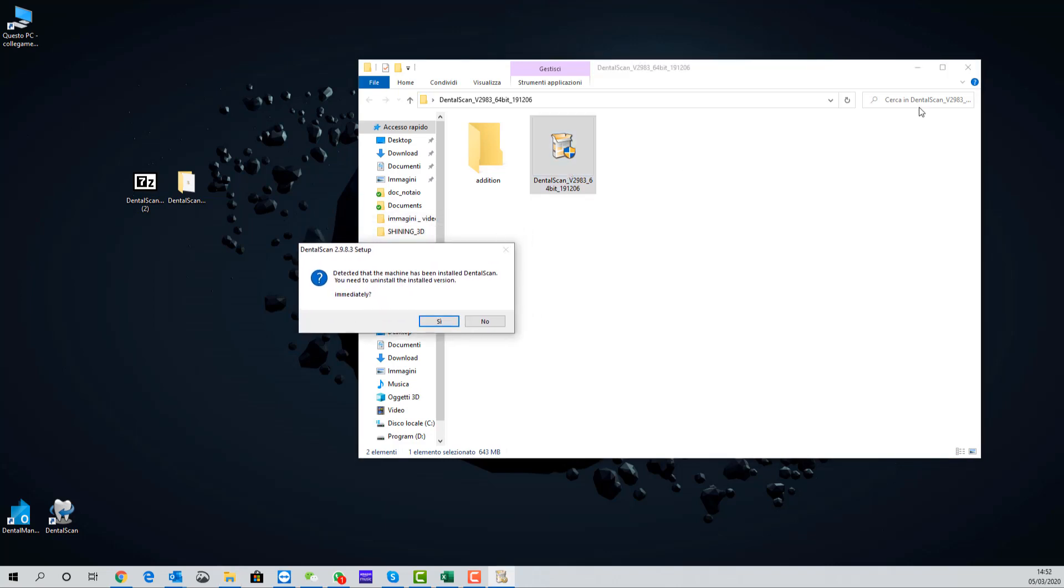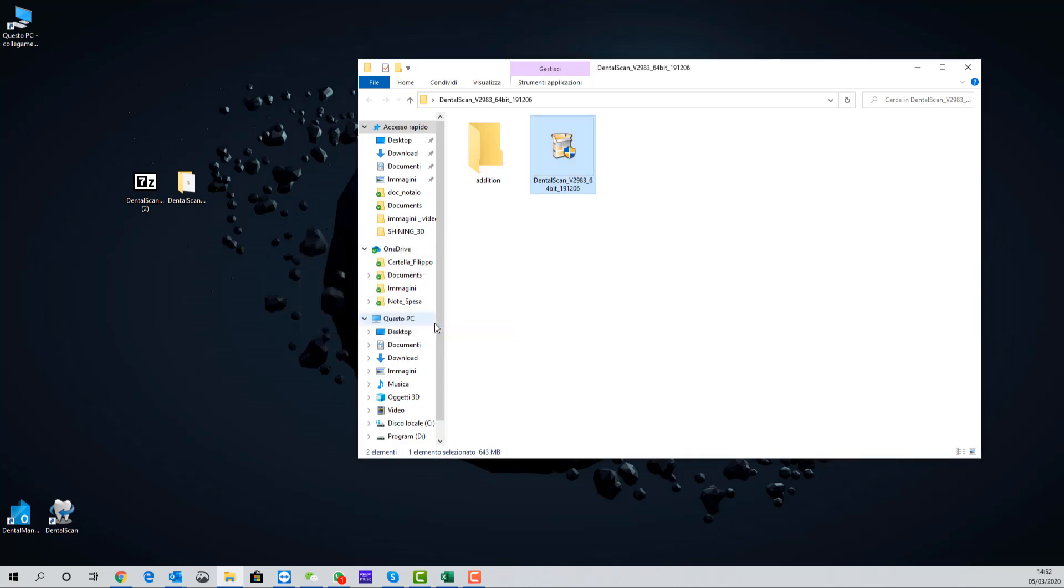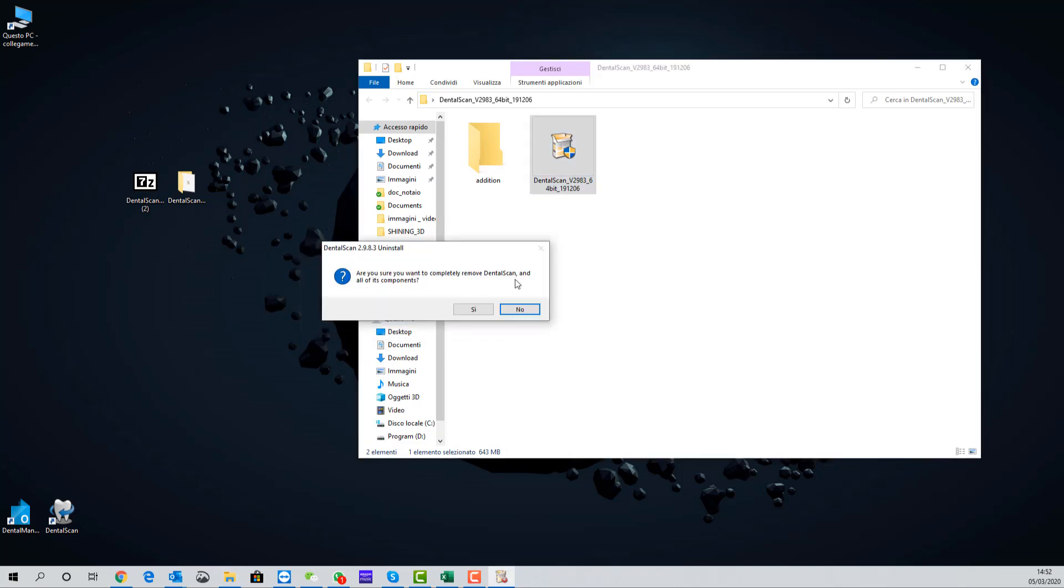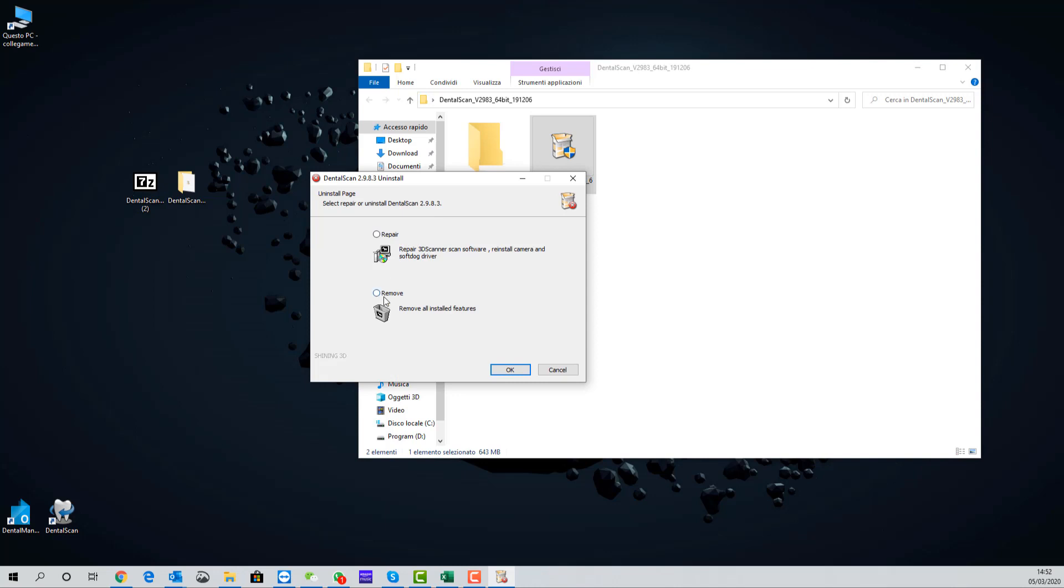The software asks us if we want to delete the previous version and of course it's necessary to delete the previous version. Select remove, ok.